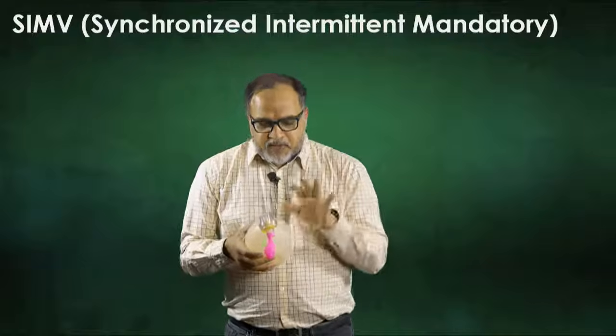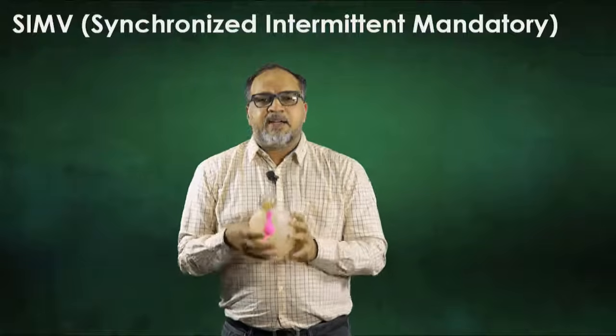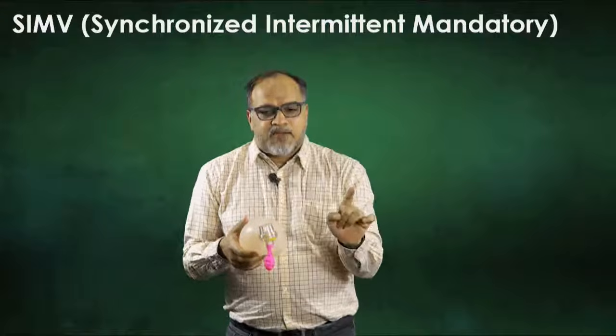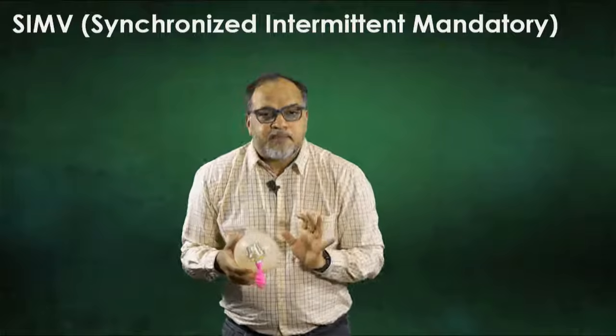Now, what happens with SIMV is that the ventilator will wait 1, 2, 3, 4, 5. If by the 6th second the patient does not trigger, it will give a mandatory breath of 500 ml tidal volume, whatever you have set. It will again wait 1, 2, 3, 4, 5. If by the 6th second no breath is triggered, it will give a mandatory breath. So it will ensure a rate of 10 and a tidal volume of 500, which makes it 5 liters of minimum minute ventilation to be given to the patient.